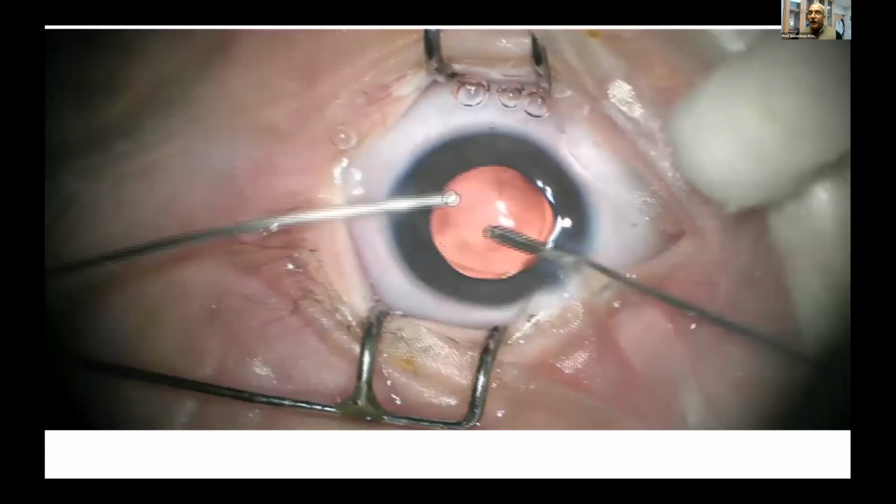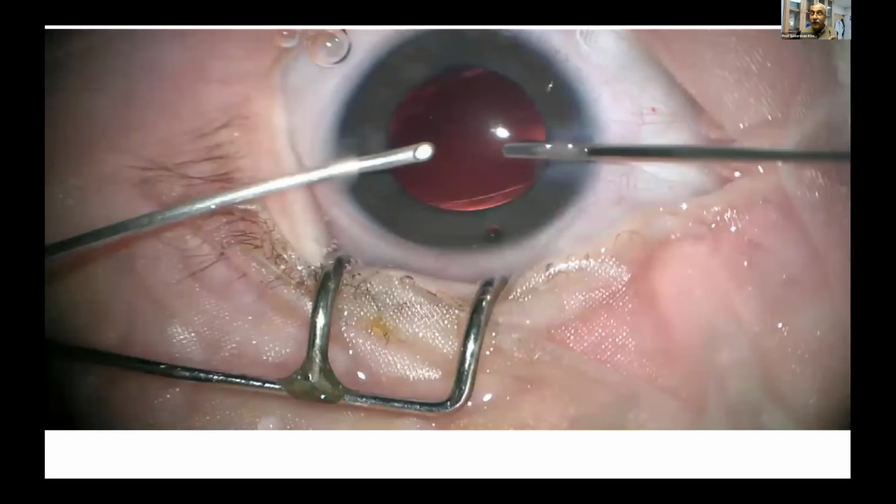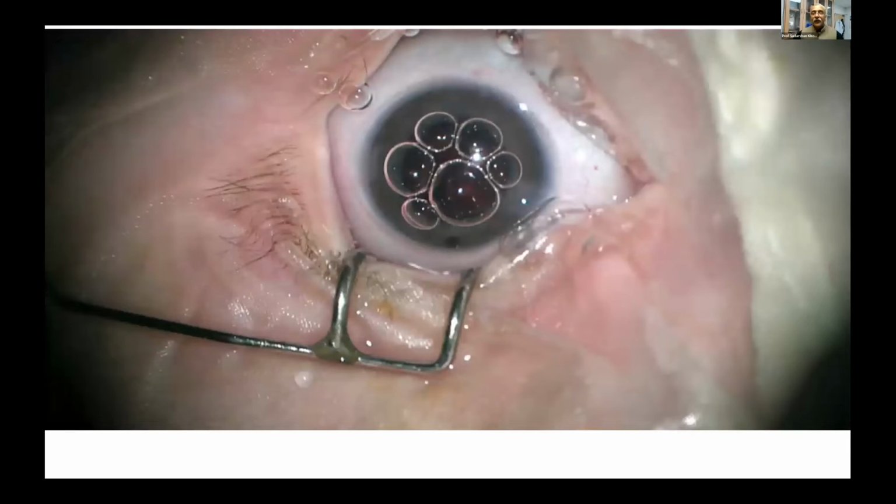But before the end, we put in an illuminator inside the eye and try to see the retina. And this is the first time anybody is looking into the back. The kid comes at an age of 1 year, 2 years, maybe a few months, in fact. And so you take a picture by putting the lens on top and document it, and you see the follow-up with this patient and tell the parents the prognosis. So by definition, I always do a PI in these smaller eyes. So that's how it is done.